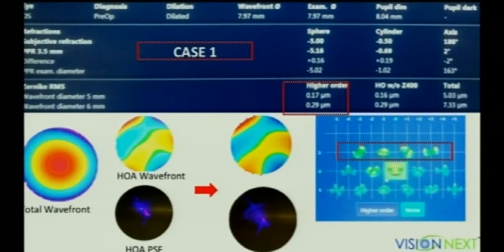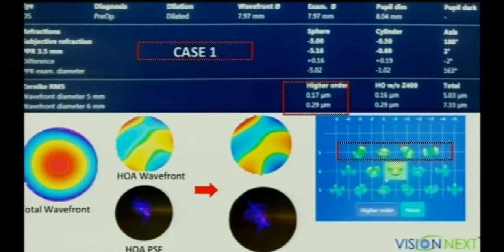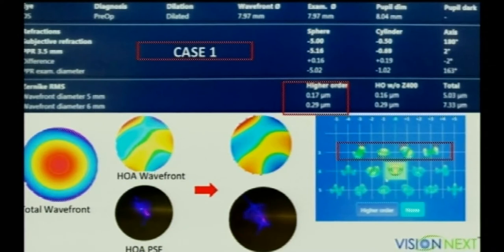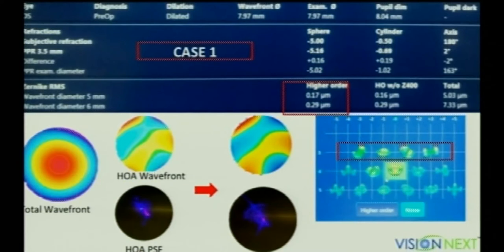This is a case of simple myopia with a very small cylinder. Her higher-order aberrations for 5 and 6 mm pupils are normal — around 0.35 to 0.4 microns or less. The total wavefront is mainly influenced by the minus 5 diopter focus. When we remove that and check the higher-order wavefront and its point spread function, we can assess the quality of the eye.